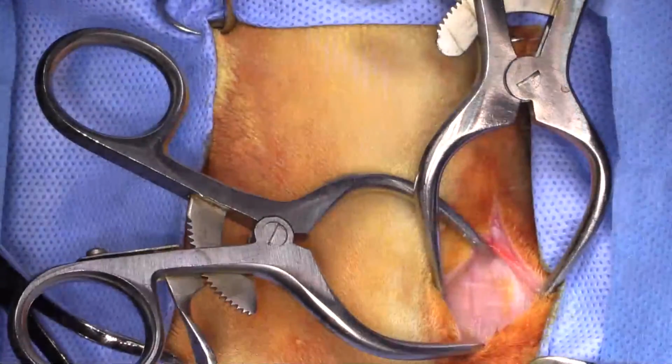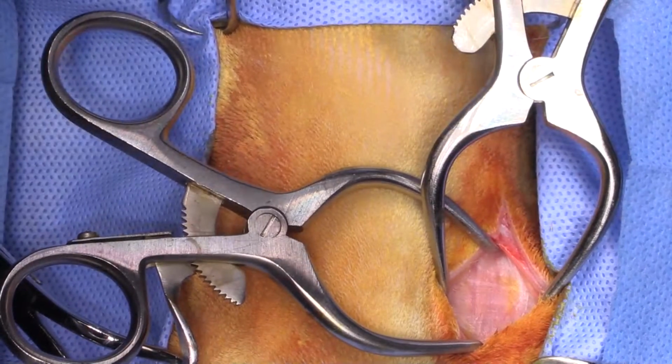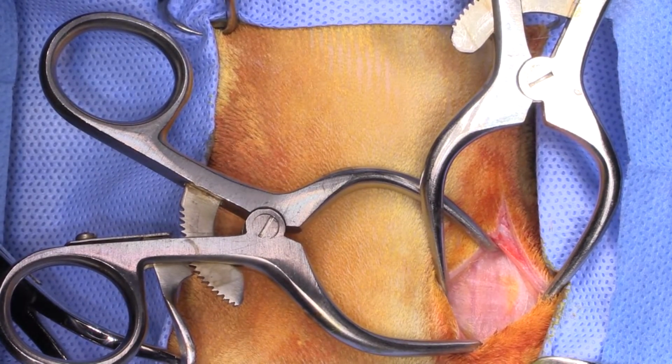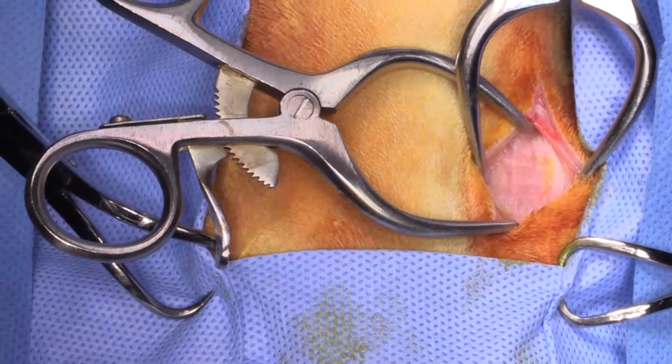So this is rostral up. Rostral is in this direction. Caudal is in this direction, just to get you oriented. And I'm just going to get the camera positioned a little bit better here, so you'll be able to see right down into the bulla.